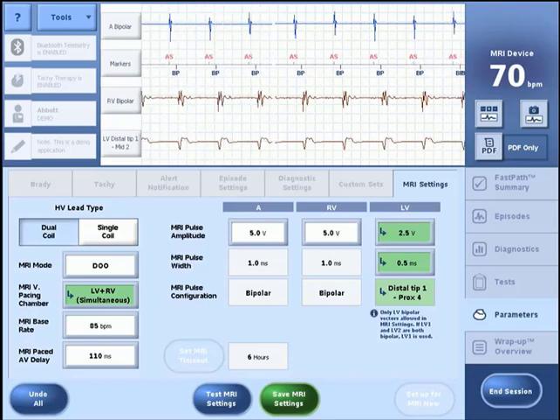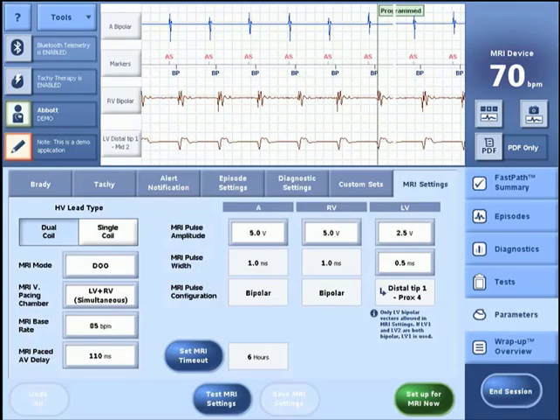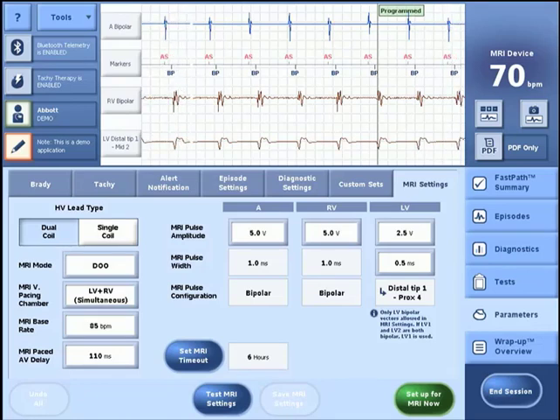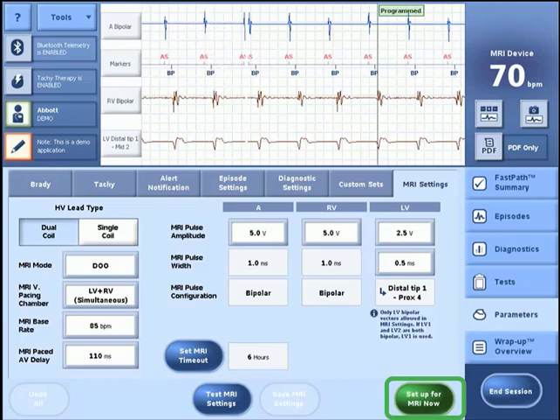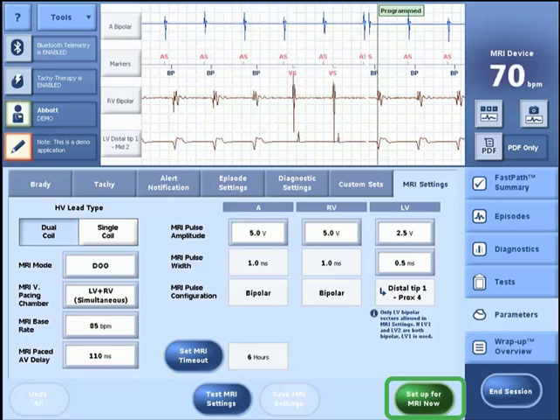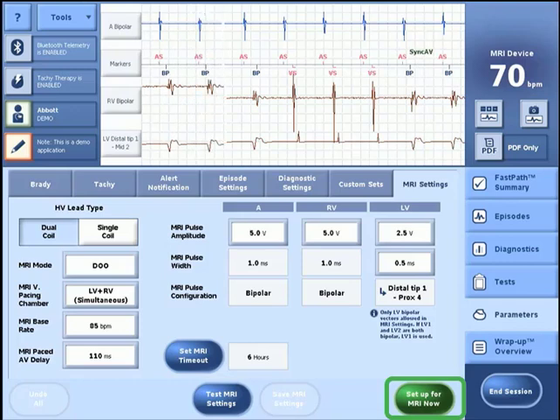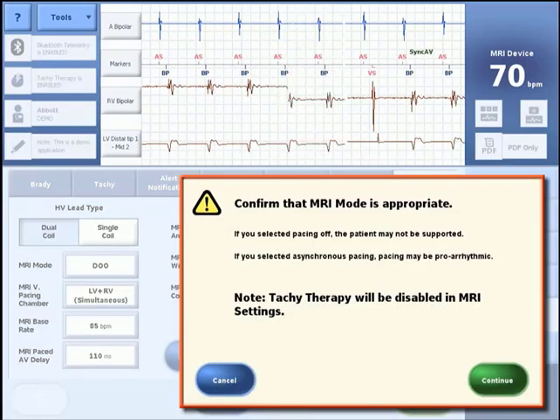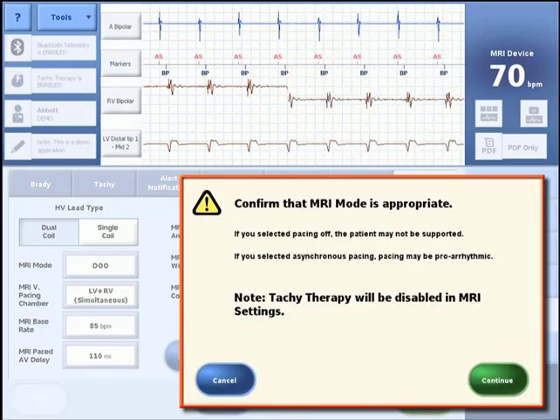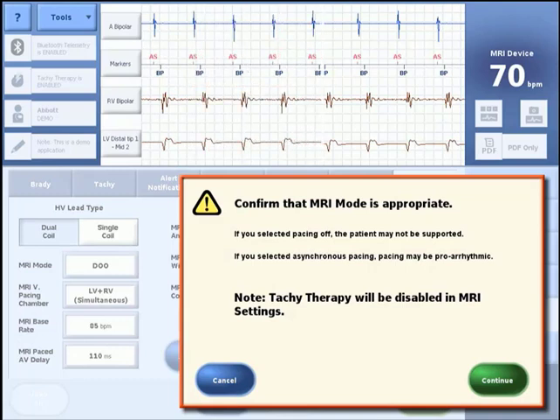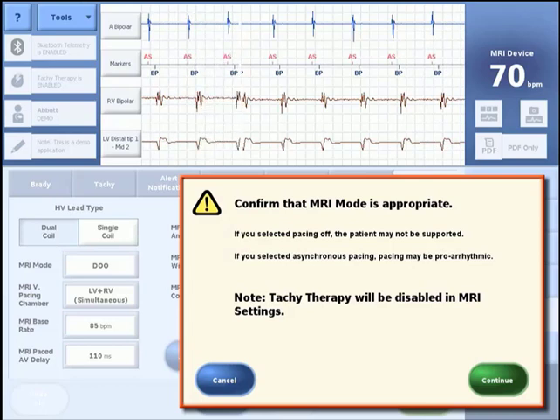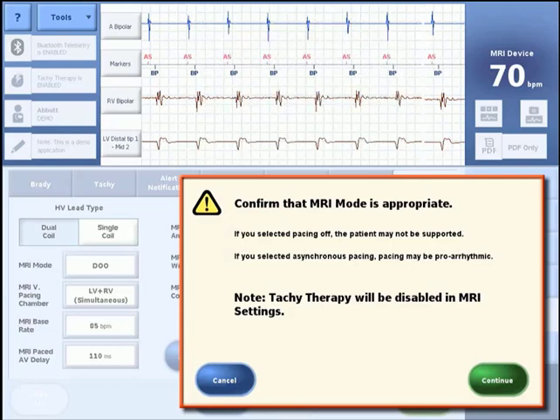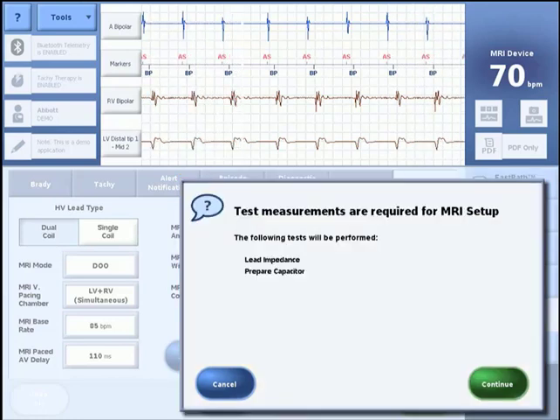Now that all parameters for MRI settings have been chosen, click the Save MRI Settings button to proceed. This will activate the Setup for MRI Now button. Pressing this button is the next step required to set up a next-generation high-voltage device for MRI. The following message will display to confirm that the chosen MRI pacing mode is appropriate. If you selected pacing off, the patient may not be supported. If you selected asynchronous pacing, pacing may be pro-arrhythmic. Press Continue to confirm that MRI pacing mode is appropriate.